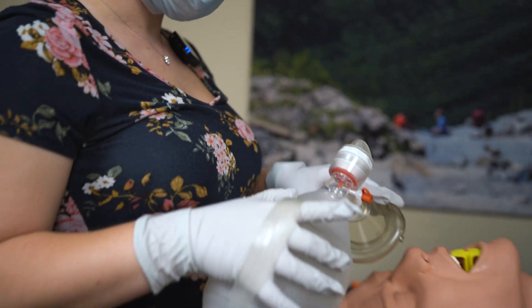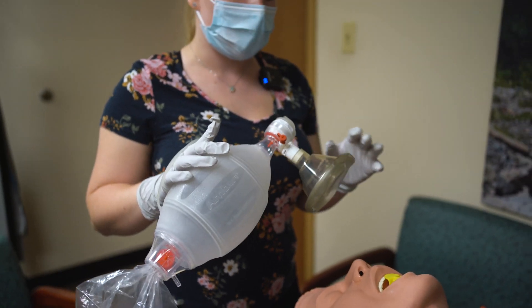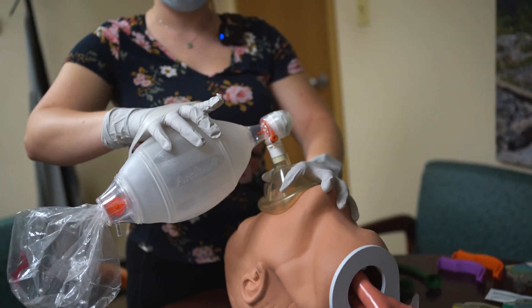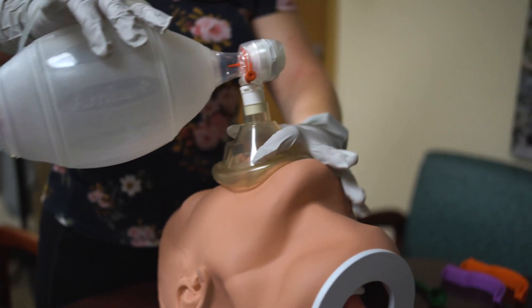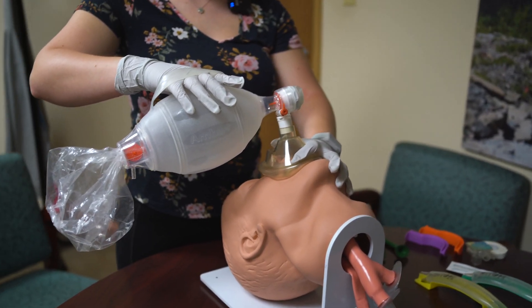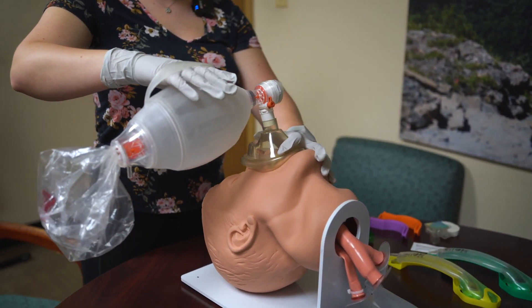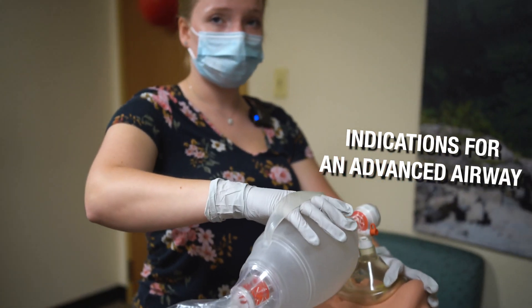I'm going to start ventilating the patient — I'll hook up my BVM to oxygen at 15 liters per minute. I'll place it on the patient's face using the CE grip: C pushing down, E lifting up. I ventilate one breath over one second every five to six seconds. I'll apply a pulse ox to the patient's finger to see if breathing is improving. The pulse ox is not improving and I start to feel resistance while ventilating.